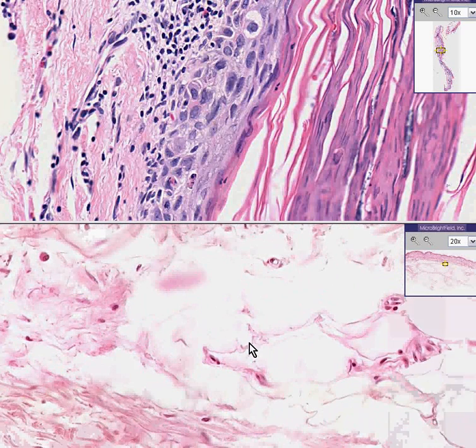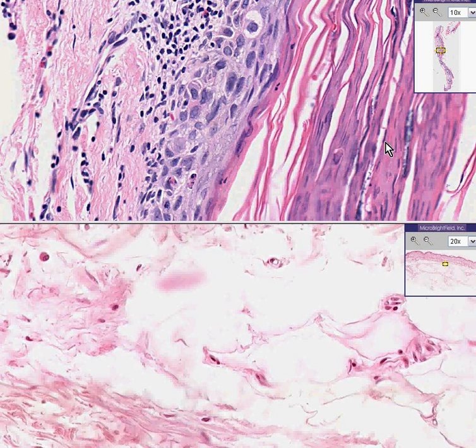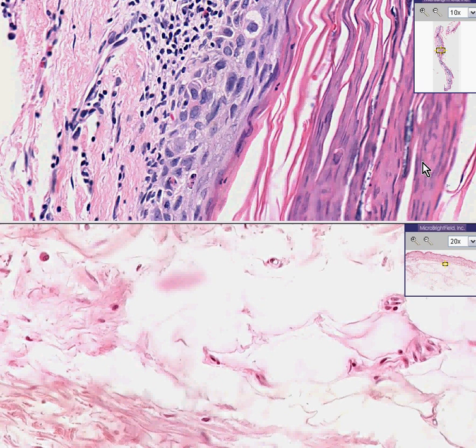Classic textbook normal skin. But what do we have on top? We have a thickened keratotic layer — a thickened stratum corneum. Furthermore, nuclei are within this hyperkeratotic stratum corneum, which by definition is parakeratosis.